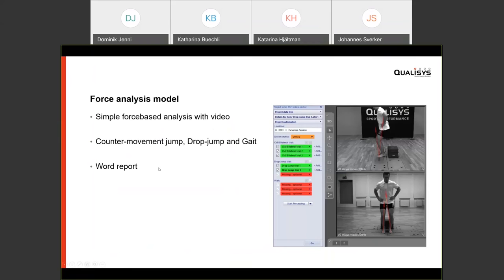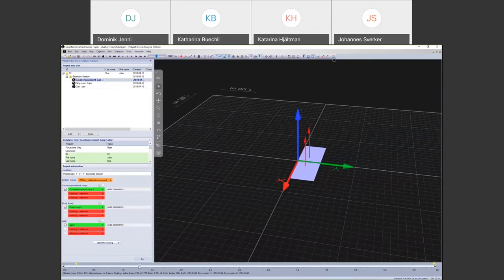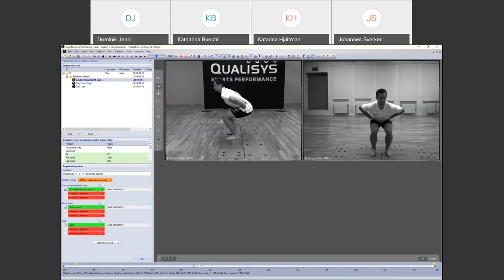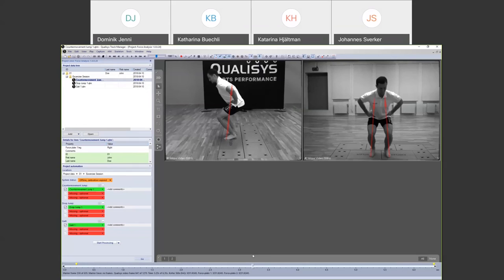The Force Analysis Module uses the same type of setup as the gait analysis module. You have the force plates displayed, and since it's video-only, you see force data in the 3D world. In the 2D video view, you can turn on the overlay to see force arrows together with the video.